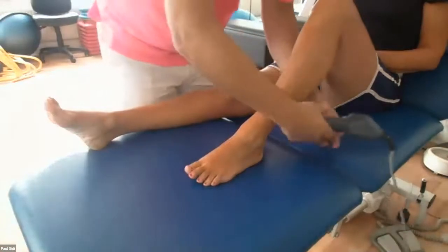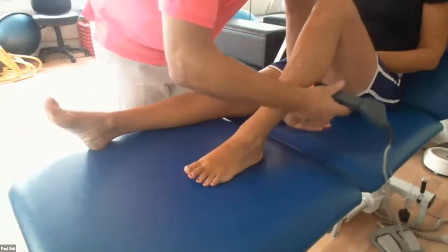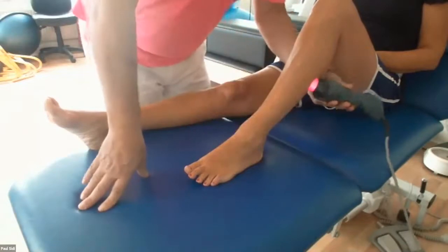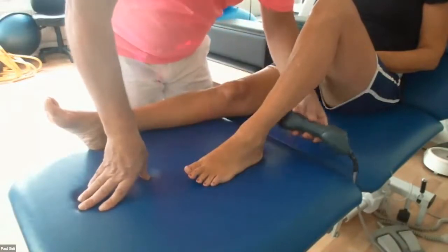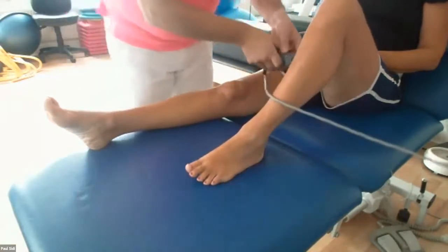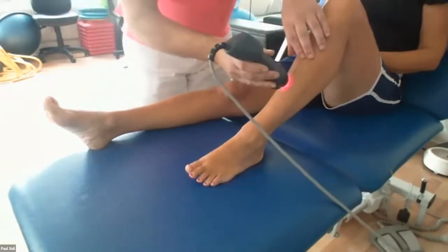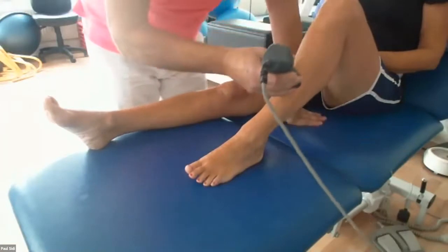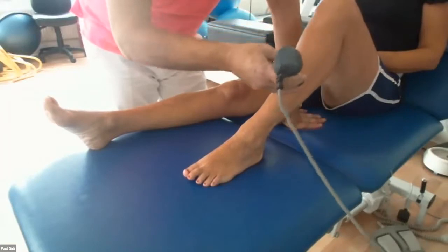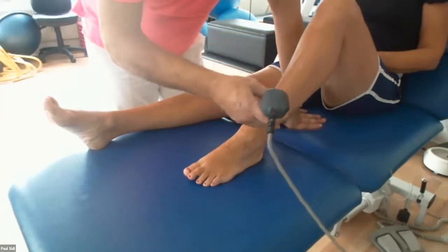What we do is we're going to get in here. So you're thinking, what the hell is he doing up on the leg here? I'm just doing a bit on the... can you see this going here? I'm just doing all the gastrocnemius. I'll move it around, all around here. Right now, on this, really have a good go on the tibialis anterior as well, because this is a big area which it joins to some of those mid-tarsal bones.